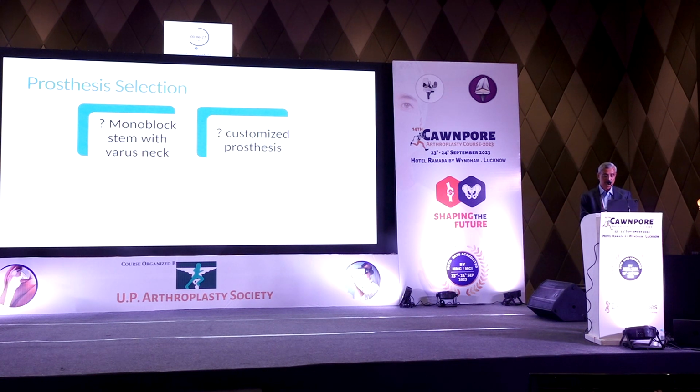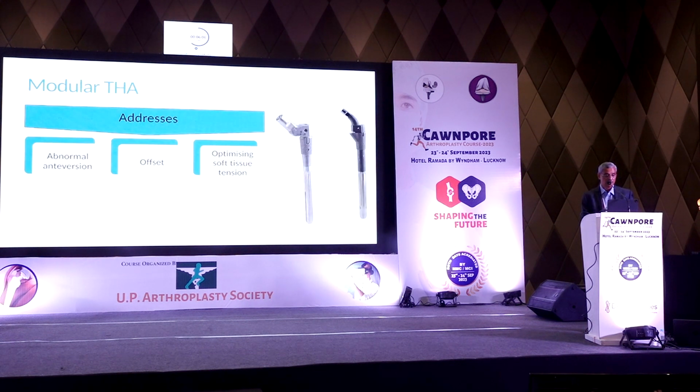People have talked about customized prosthesis, but restoring the offset, restoring the hip center is not always easy with a customized prosthesis. Probably it's not possible. So that's where the role of modular hips comes into play. With customized hips, you have problems with restoring the offset, anteversion and the limb length. So like I said, the modular hips are definitely a boon.